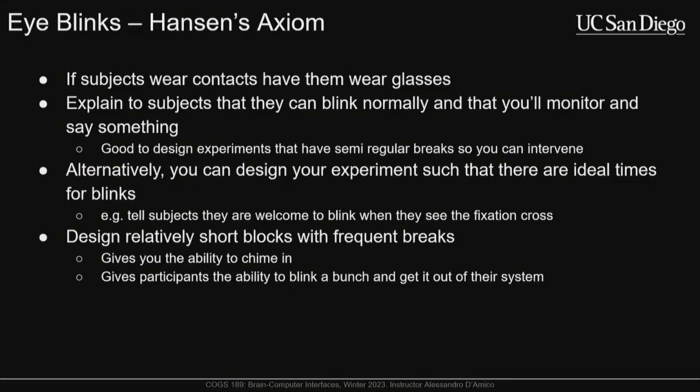Oh, yeah. Can you go over the rationale of having people wear contacts, or if people wear contacts, having them wear glasses? So this is something that Steve Luck says. Usually I would have it the opposite. Yeah, well, typically glasses can be a problem when you're recording EEG because the bars of the glasses have to go somewhere, right? When the participant has a cap on, they have electrodes, some of them on the temple where the glasses are going to sit.